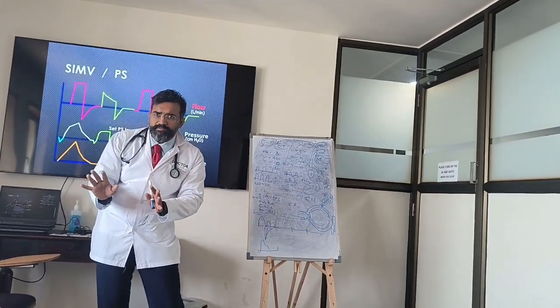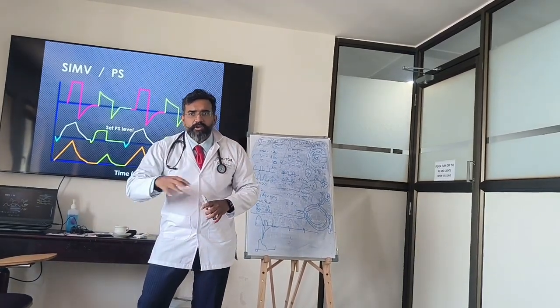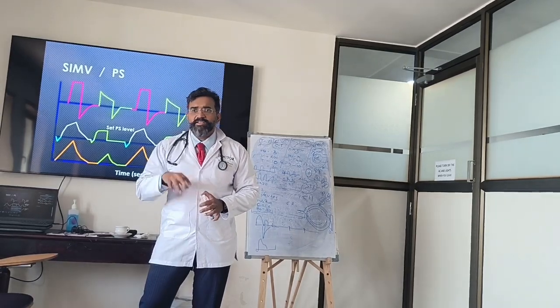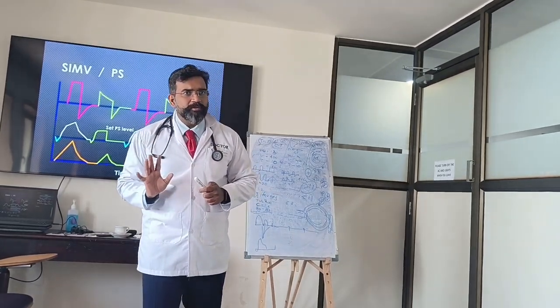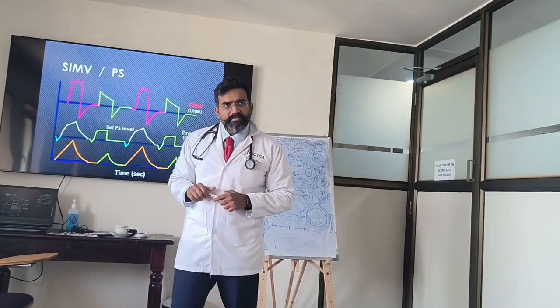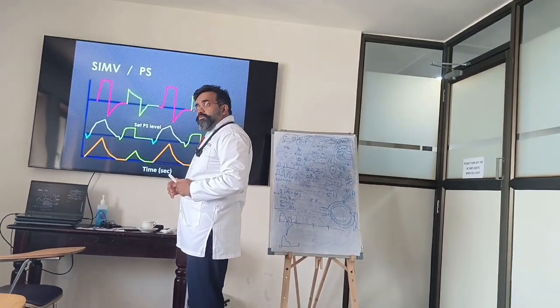But don't confuse yourself. Now that has all become simple. It has become just set it on the ventilator. The ventilator algorithm moves it in such a way that it creates two windows: an SIMV window and a patient window. That's all. That is what you must remember. Clear? Clear on this?